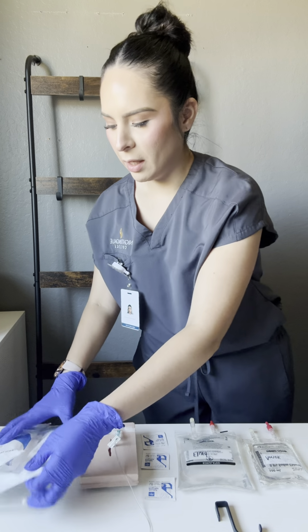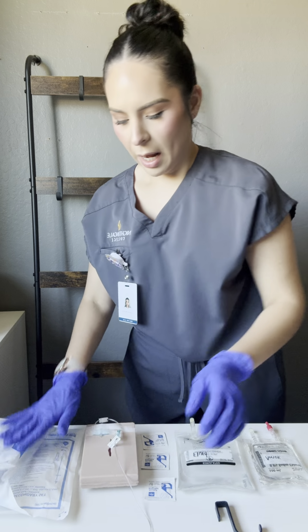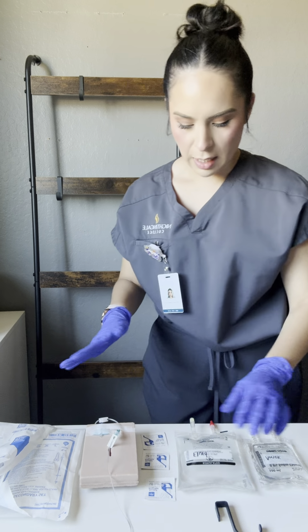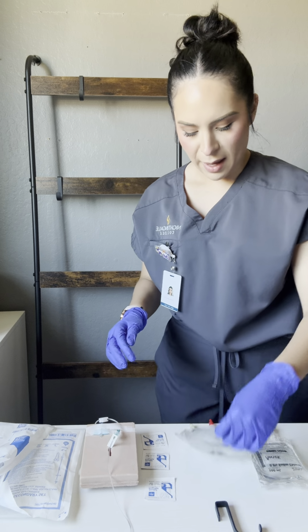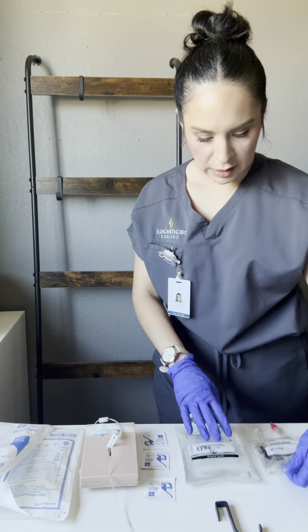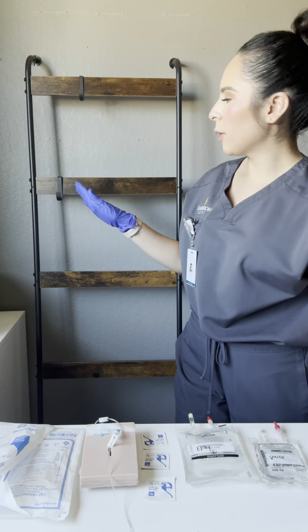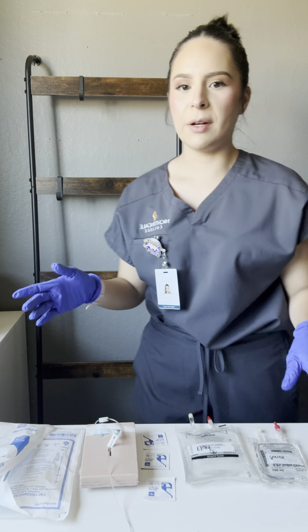So I have my primary and secondary tubing set. I have my patient's IV access with the luer lock at the end. I have 3 alcohol swab pads. I have my fluid, and then I have my bag for amoxicillin, and then I have my hook for my fluid, and then my hook for my piggyback for amoxicillin.